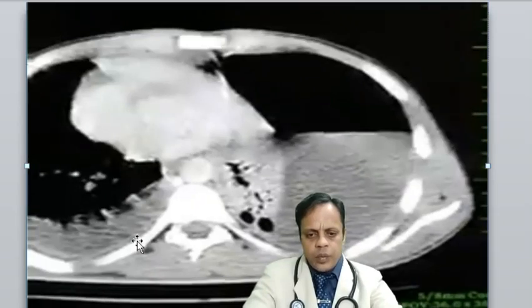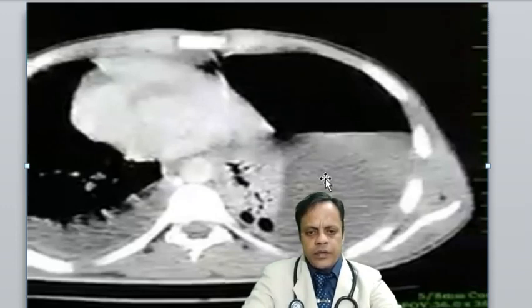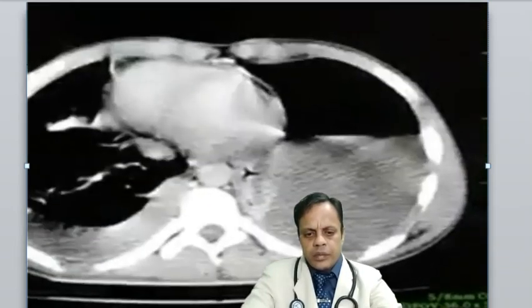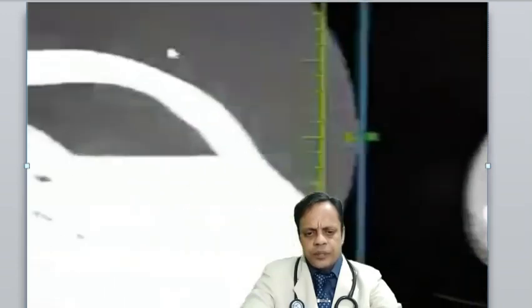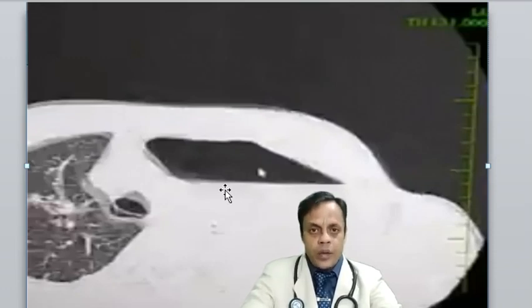Now look here. Both sides there is fluid. So this is pleural effusion. This is air above the fluid, giving the straight air fluid level. So we can appreciate that this is left hydropneumothorax and right sided pleural effusion. Now in the other window, HRCT, the slight difference is that in HRCT fluid will look hyperdense or bright. Here we can see this is also fluid, a straight fluid level, but it is not looking grayish, it is looking white or hyperdense. We use specifically the term hyperdense.